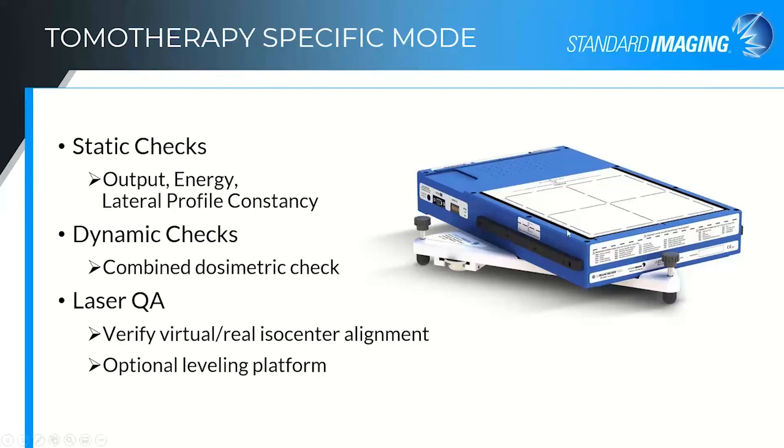You can also do a dynamic check where you treat any of those 3 chambers as essentially a patient tumor and deliver a certain percentage of dose to those specific units, those specific locations, and report on those. So you've tested your levels, your isocenter alignment, and all of the dosimetry all at the same time.